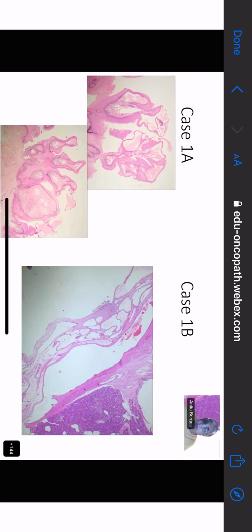So, in other words, we have to assess. We don't know what ultimately is going to help us or hinder us in making a diagnosis, but we have to make an assessment as to what are the relevant, and this is the operative word, relevant positive and relevant negative findings. So a description is not about only what you see, and there are many irrelevant things that one sees.